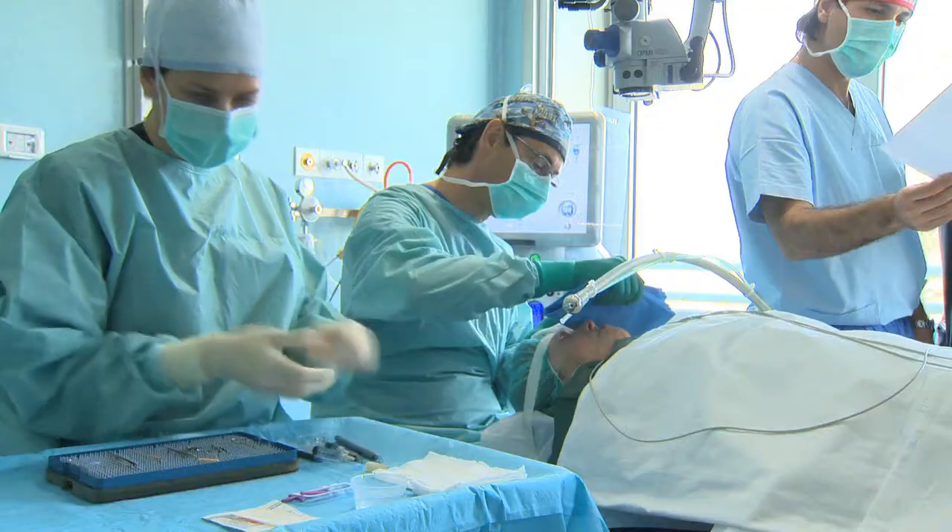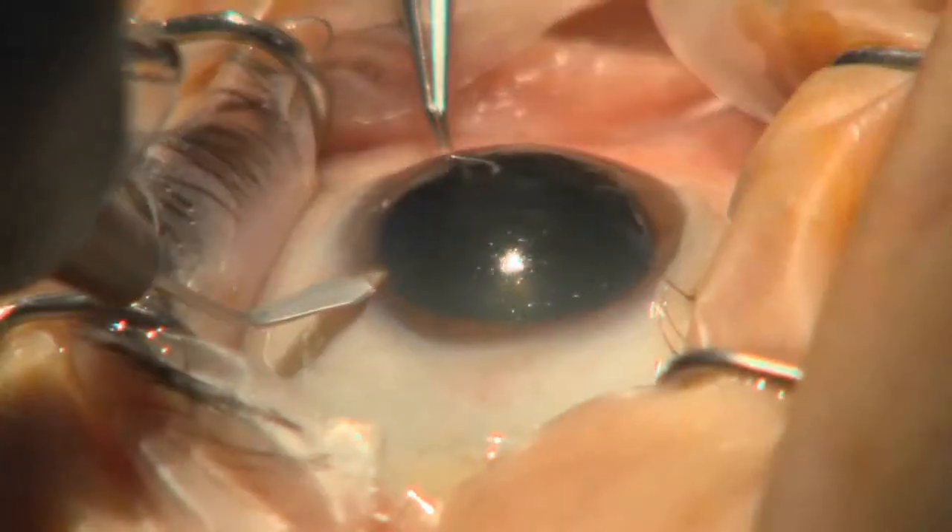The biflex lens is a very convincing lens which is particularly easy to insert. This is due to the implant's flexibility, a highly useful characteristic when performing surgery through very small incisions.